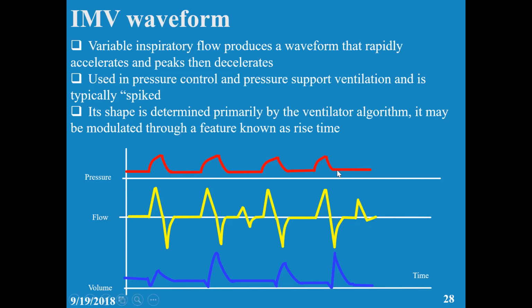Anybody? It's mandatory because it's the same, no change. Second, you can see there is a wave and the patient is breathing, but there is nothing here. So it's not synchronized. Okay? You can see the patient breathing here, but it's not synchronized, so it's not SIMV, it's an IMV. And it's only mandatory. So this is IMV ventilation.